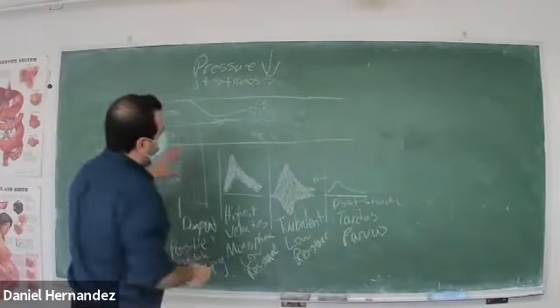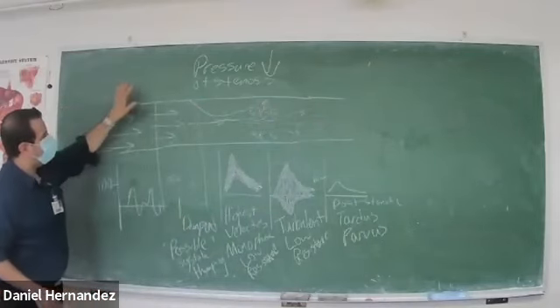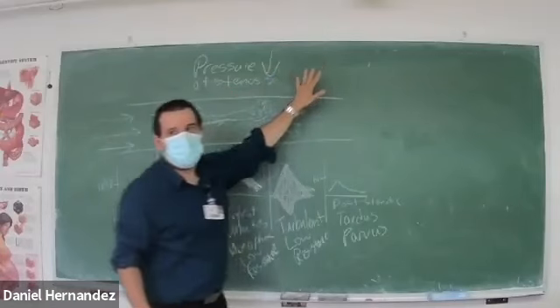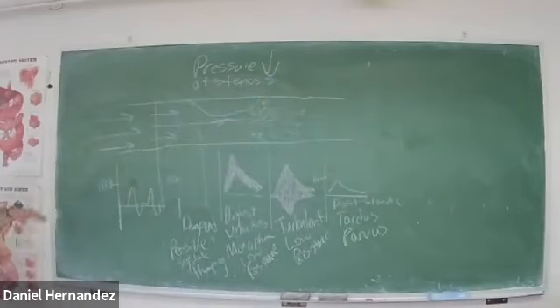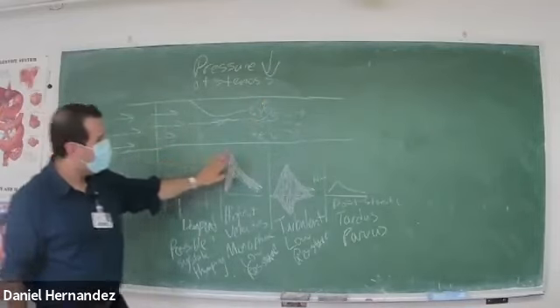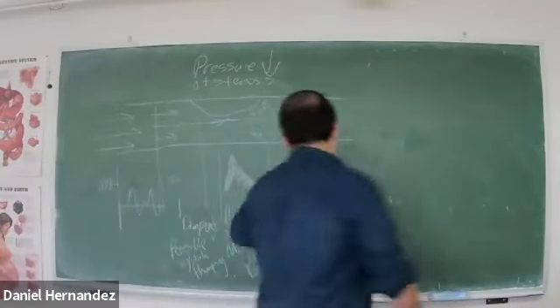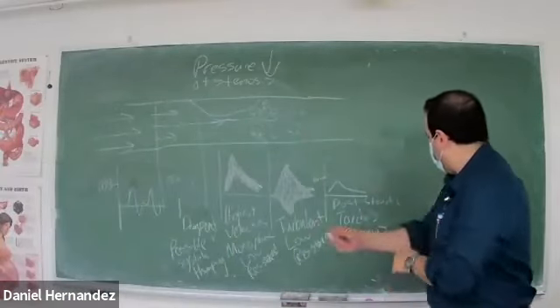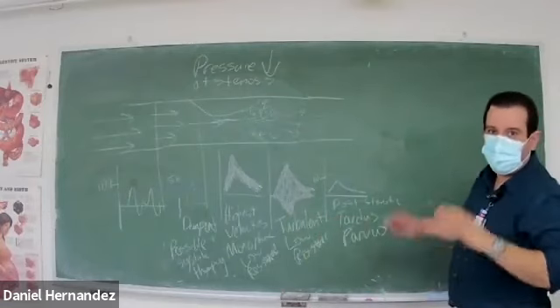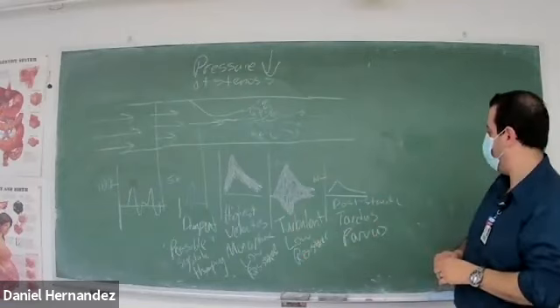And as we progress further down the vessel, post stenosis or after stenosis, think of this as pre-stenotic, within the stenotic lesion, and then post stenosis, after stenosis. So being able to label what your waveforms are going to be, is it going to be a pre-stenotic waveform, or is it going to be a post-stenotic waveform? So after we get past our turbulent phase, we're going to wind up in our post-stenotic phase, and this is going to be our tardus parvus waveform. So post-stenotic tardus parvus waveform.